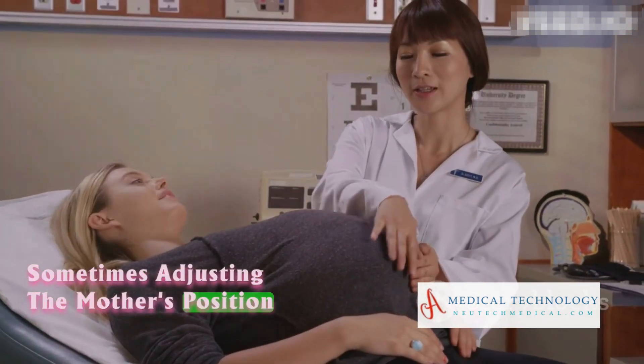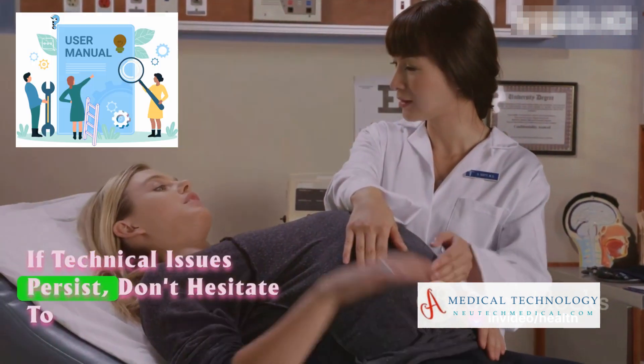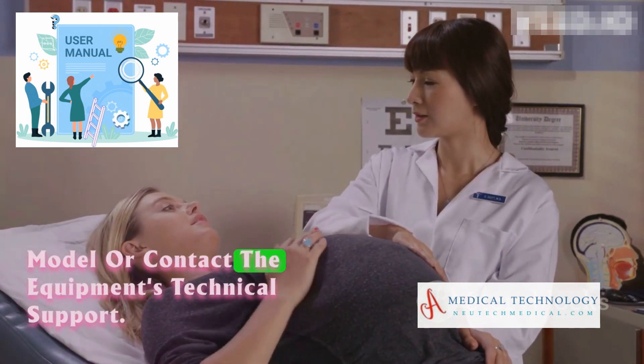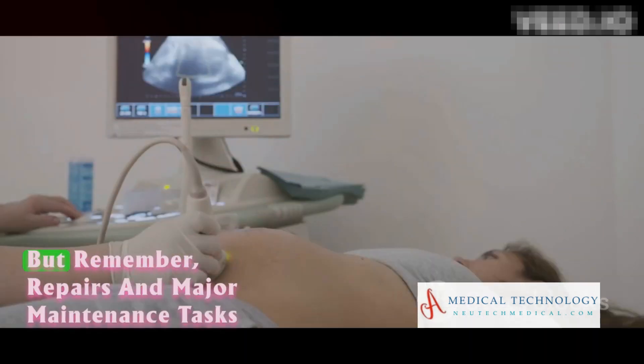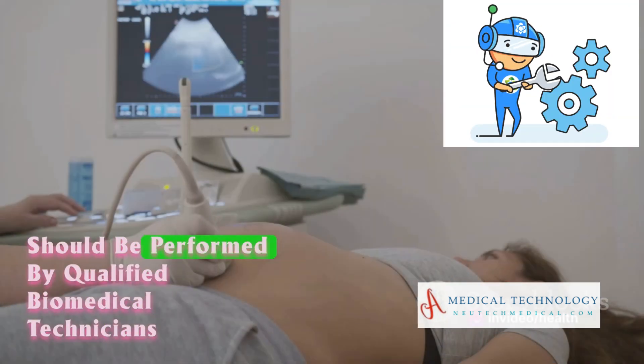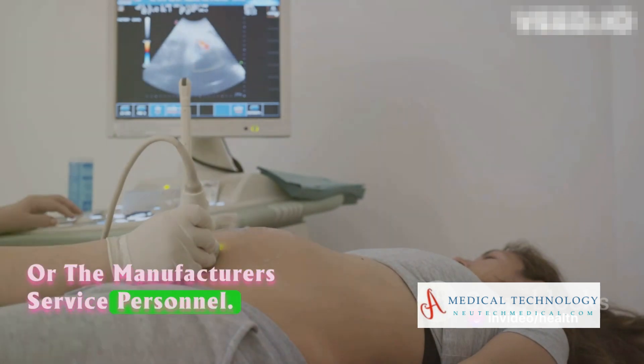Sometimes, adjusting the mother's position may improve signal quality. If technical issues persist, don't hesitate to consult the user manual for the specific model or contact the equipment's technical support. But remember, repairs and major maintenance tasks should be performed by qualified biomedical technicians or the manufacturer's service personnel.